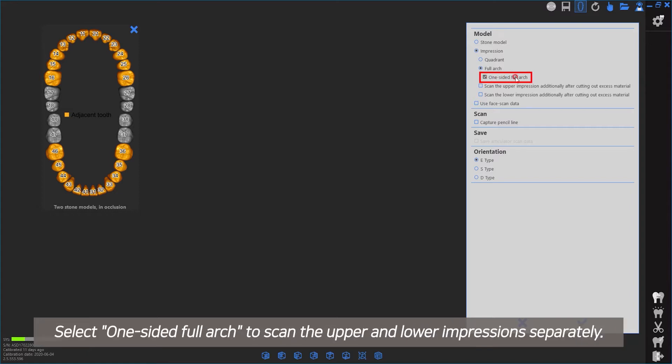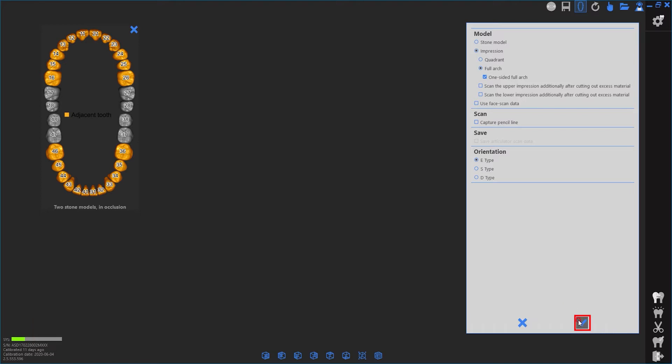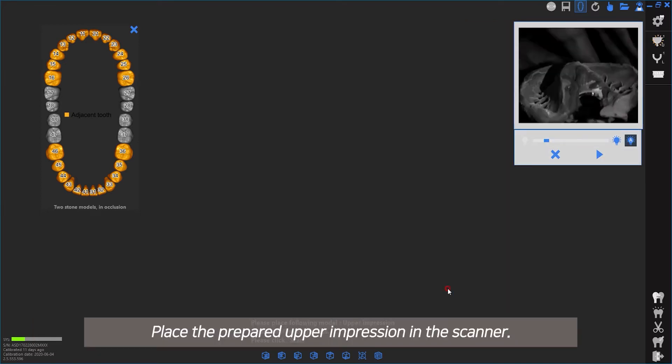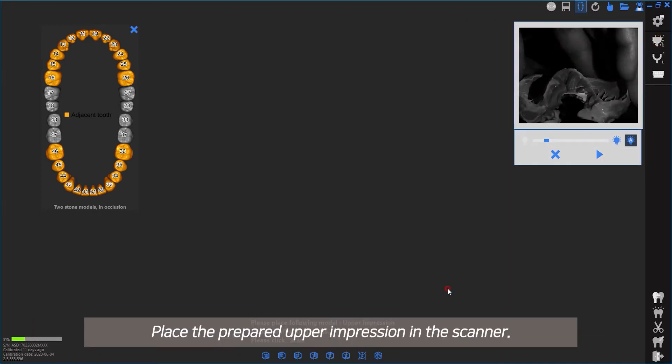Select to scan the upper and lower impressions separately. Place the prepared upper impression in the scanner.